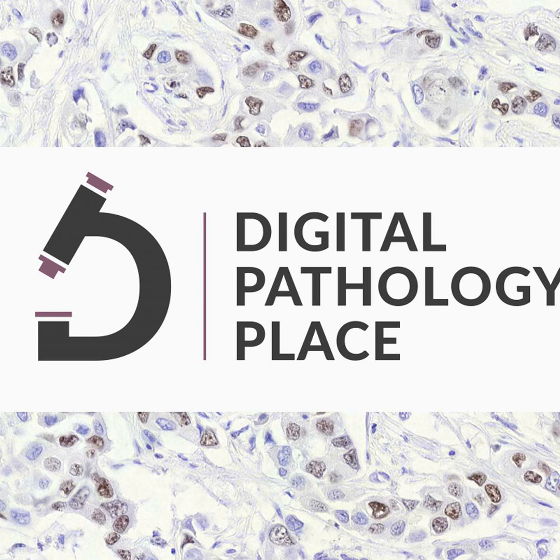Which ones are Sectra and Paige? So there is some interoperability there, but it remains for them to relax that stance and separate the components and approve them separately. In radiology, for example, you approve CT scanners separately from display software, separately from display hardware, separately from archives, if the archives even need approval at all, because they're just basically arrays of disks with a little bit of management software. So the componentization, the deconstruction of PACS, as it was called for a while in radiology, is not really enabled by the current regulatory market for digital pathology in the same way it is for radiology.